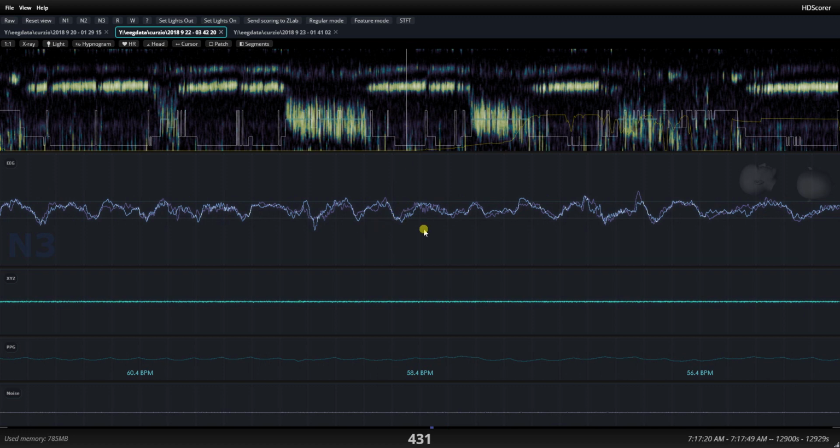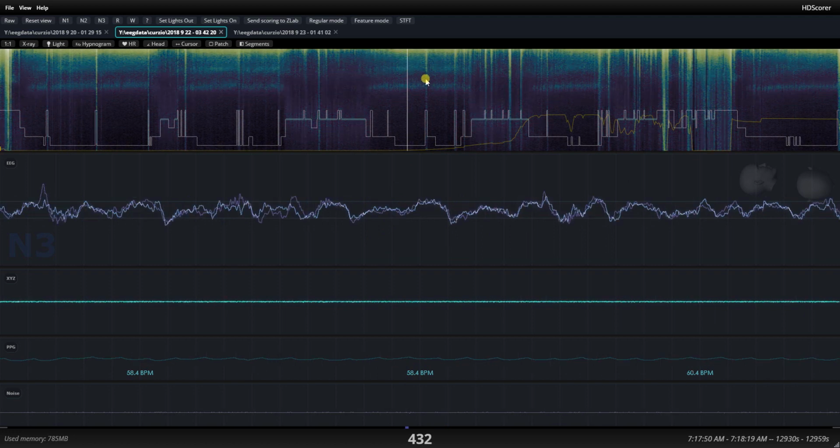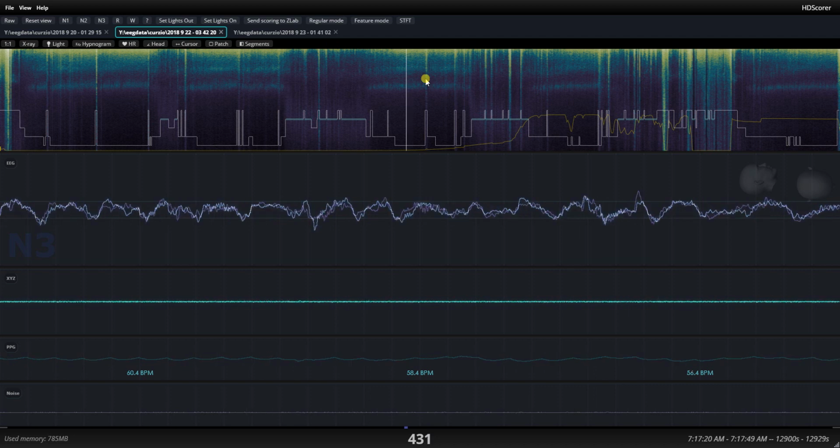Even though I think these are heart rate interferences, you see that by removing the X-ray and going to the spectrogram, I don't see any horizontal lines in the spectrogram, which tells me that that is actually not that. Also, you can use the PPG and verify the peaks and troughs, and see I've got 4 heartbeats in this range, whereas I only have 2 oscillations over here.